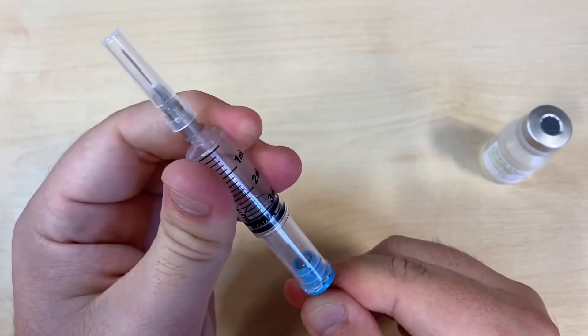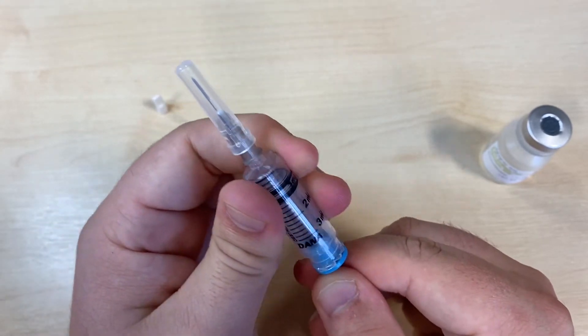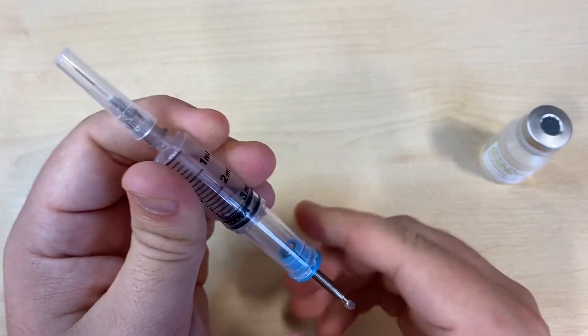Lubricate the inside of your syringe, pushing the plunger all the way to the top, and bringing it down all the way to the bottom a number of times.